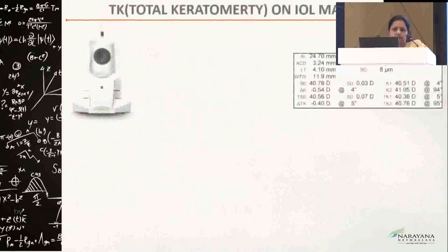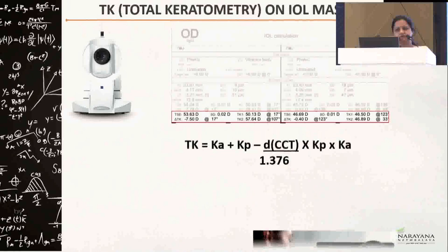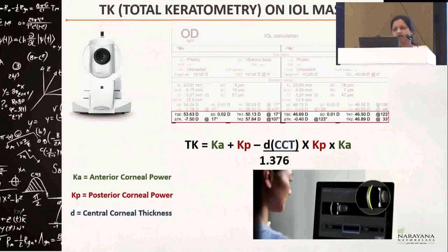Coming to TK, or the total keratometry on IOL Master, it gives us both the anterior and the posterior curvature. The anterior is measured by telecentric keratometry, whereas the posterior cornea is measured by a swept source OCT. It doesn't directly give us the posterior and anterior algebraic sum. It actually modifies what it calculates for the posterior with an algorithm and changes the posterior K to the refractive index of 1.3375 so that it can be directly used for our IOL calculations.